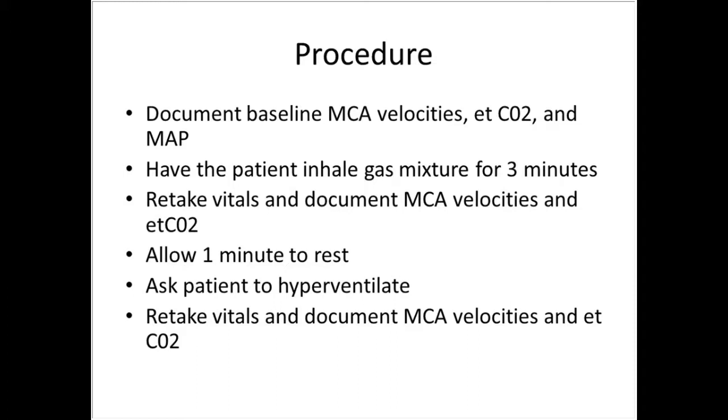We'll ask the patient to hyperventilate, and we do that with the patient so that when we start getting a little lightheaded, then we know our patient's getting lightheaded. We like to see that end-tidal go below 30, but certainly not below 25. And one last time, we take the vitals and document MCA flow velocities and end-tidal CO2 for calculations.